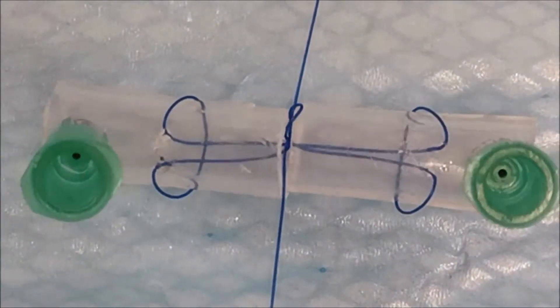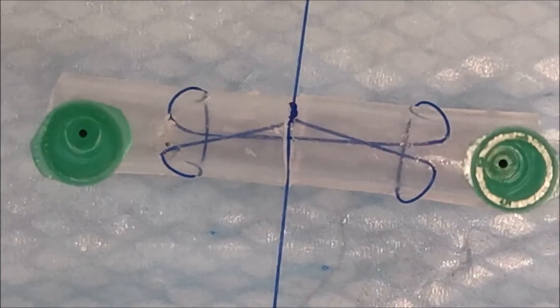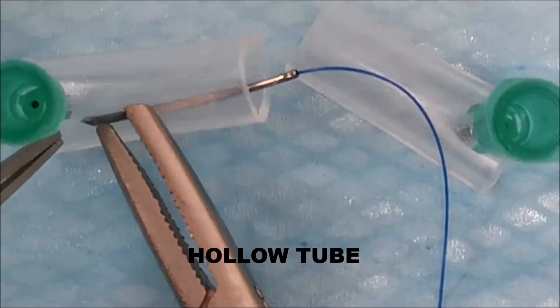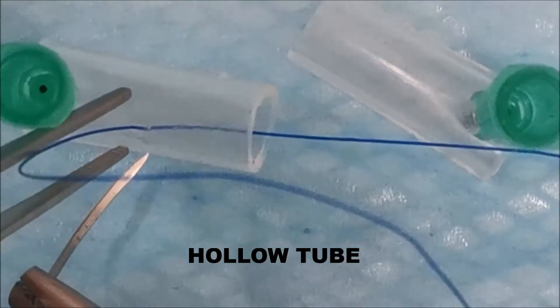When you pull your knot tight, do it perpendicular to the tendon ends and it will bury your knot inside the tendon ends. The next technique is a four strand cruciate.